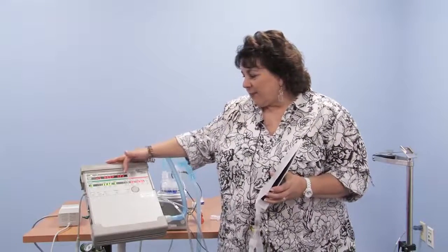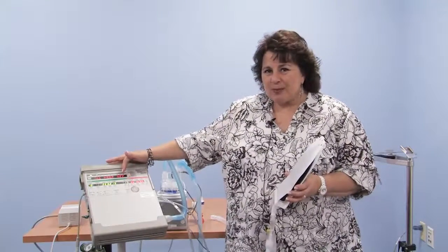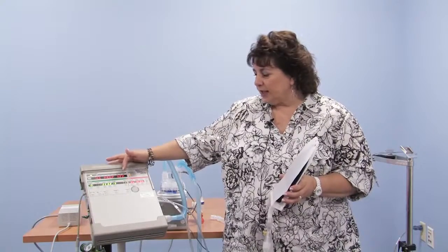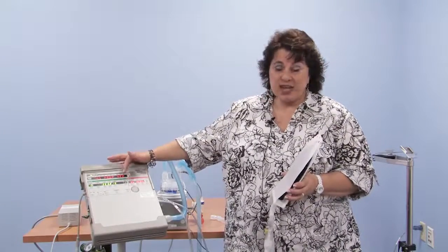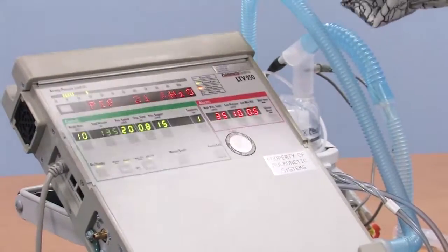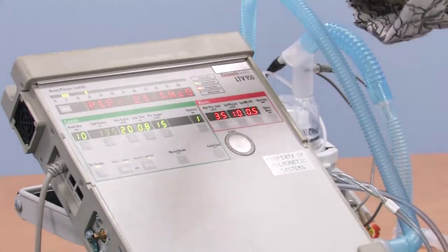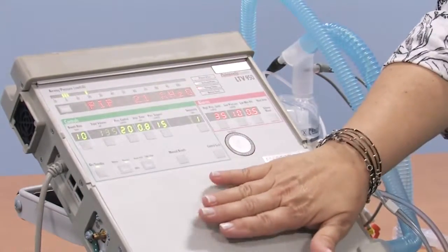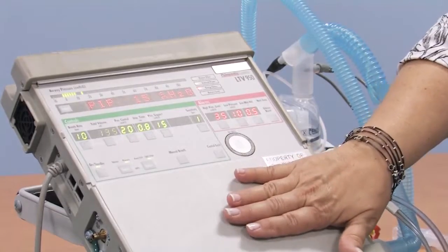You see it saying high PEEP off. If you've disabled an alarm internally, the machine lets you know. So periodically, if you turn off an alarm, it will tell you it's been turned off. And you just have to touch the button to keep going and seeing numbers again. But it wants you to know that you've internally set something off. You don't see the PEEP alarm here. Like I mentioned before, it's a computer, so there are a lot of internal settings as well.